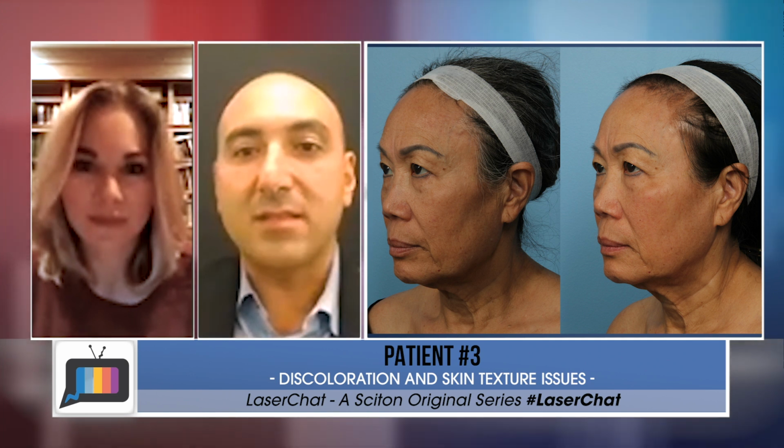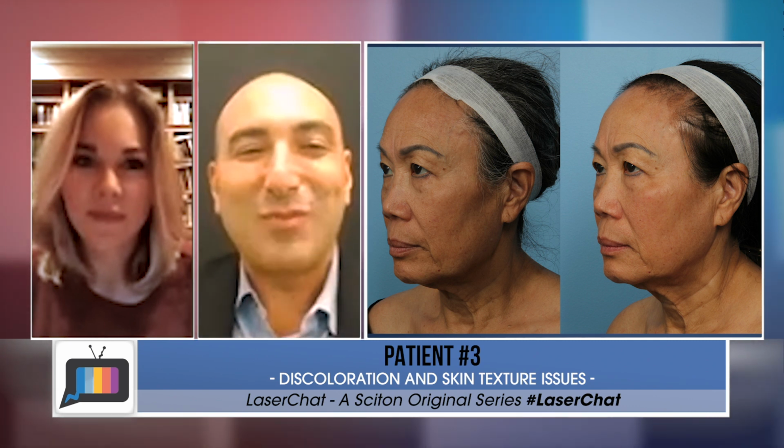Even at the highest settings, you do get the little crusty peelies, but they're smaller than they are with the Halo. And people can cover them up pretty easily, and people are just so happy. They just keep coming back for more treatments. Right. I agree. It's like a happy laser.